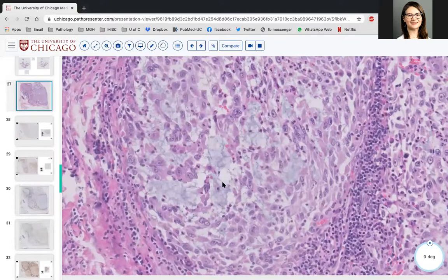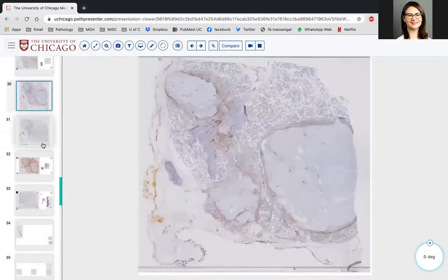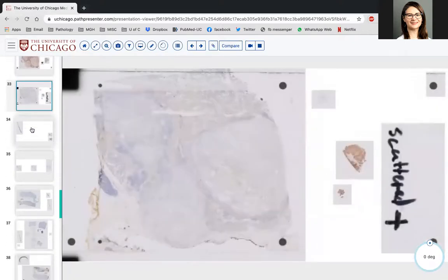pale background, right? So when we talked about stromal mucin in the pleomorphic adenoma, it was the myoepithelial cells of the pleomorphic adenoma that were, of course, secreting that stromal mucin. And it is, again, the myoepithelial cells here that are producing it. Why poor S100? Because myoepithelial cells don't always fit the same pattern.